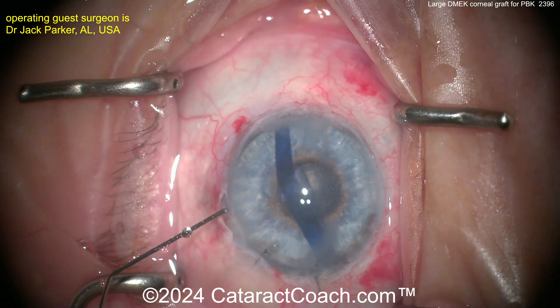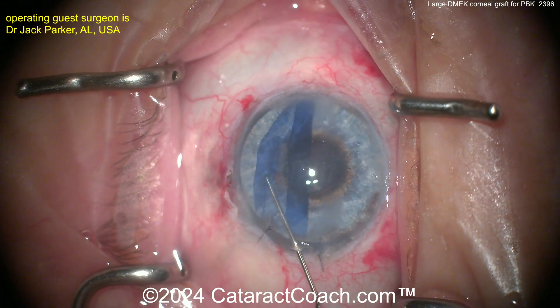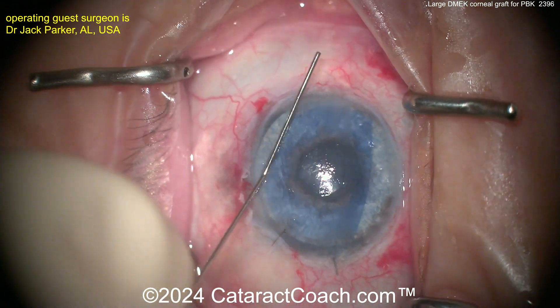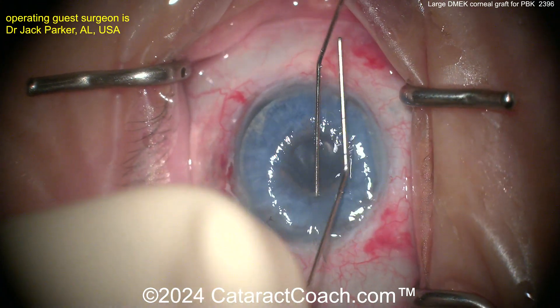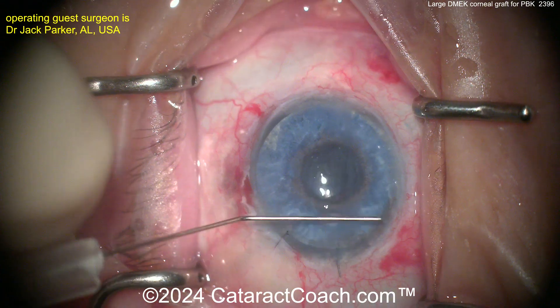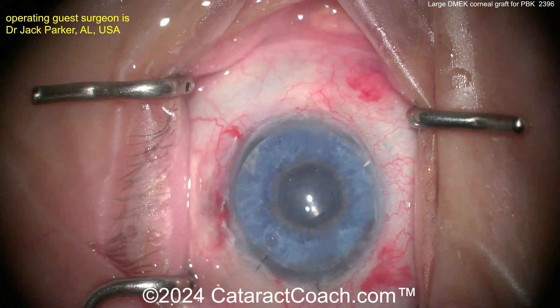This is the challenging part — it looks very easy, but this really takes some artistry. To get this graft opened up, very careful tapping techniques here, and there it goes, beautifully unrolled. Most of the graft opens up. One spot at about the 10 o'clock position is probably still a little bit tucked over, but the double cannula technique here to tap it in place — this is beautiful, this is truly artwork.